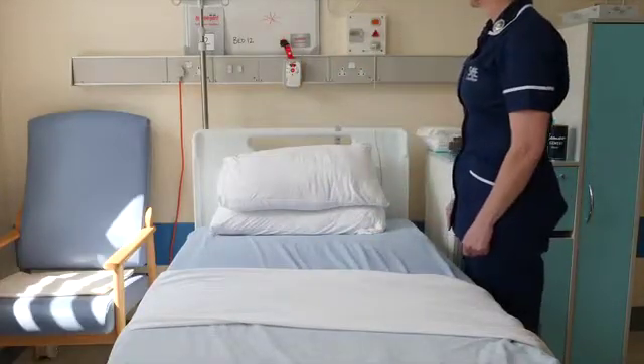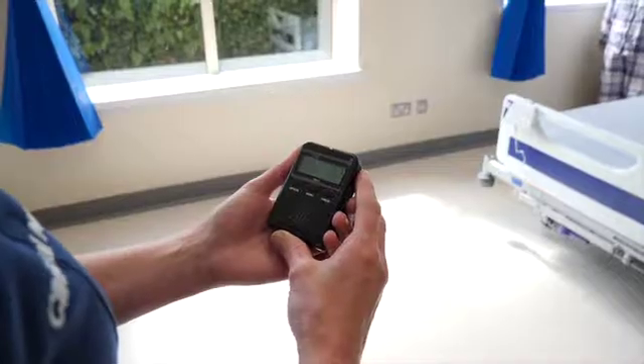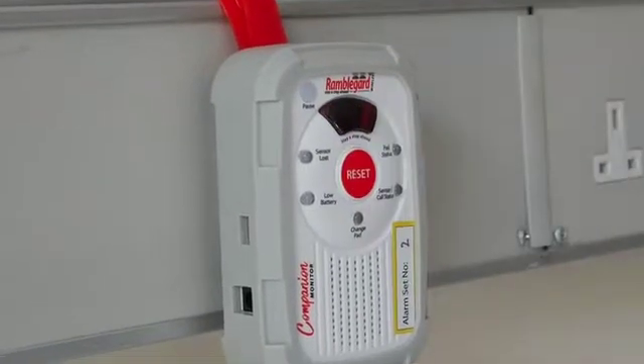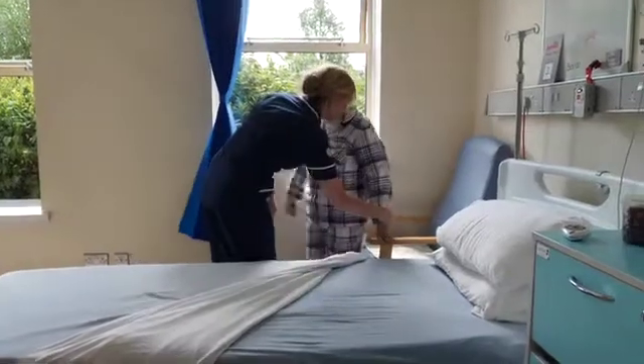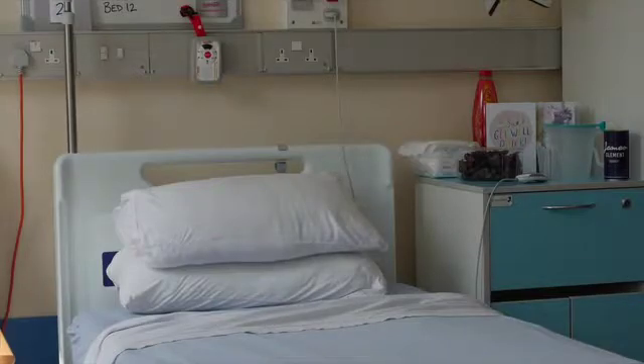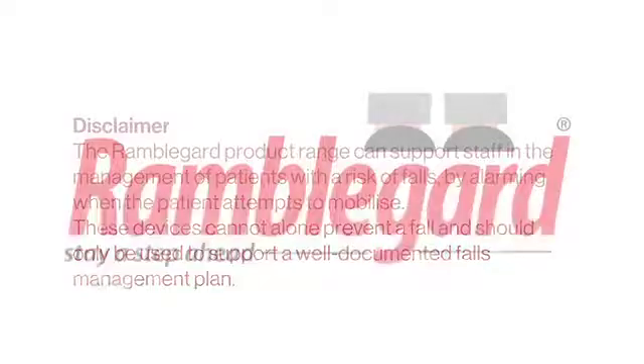To alarm the system, release pressure from the pad. The companion monitor will flash, and an audible and visual alert will be triggered on the display panel and duplicated on the pagers, as shown. The system can be reset by the nurse, who will press the reset button on the companion monitor, or by the patient, who will reapply pressure to the sensor pad when they sit or lie back down. The patient set is now tested, positioned, and ready for use.